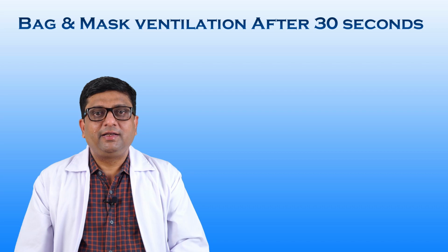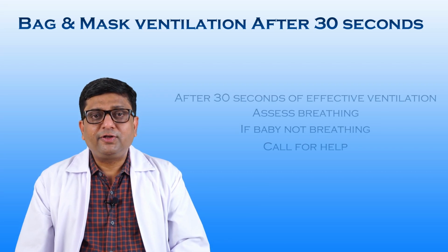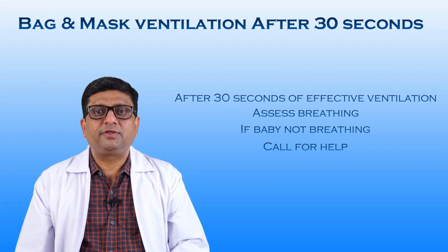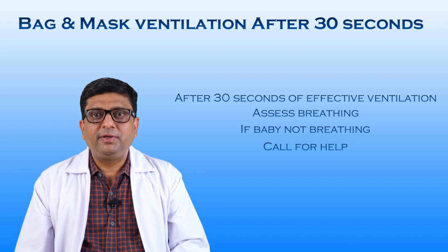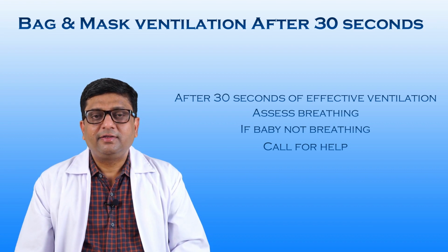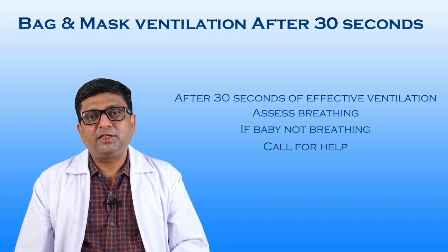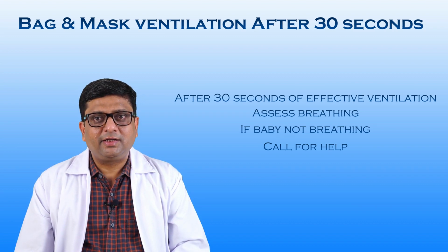Bag and mask ventilation after 30 seconds. After providing adequate ventilation for 30 seconds, assess the baby for breathing. If the baby is not breathing, then call for help. As already explained in the beginning, call another healthcare worker trained in NRP.